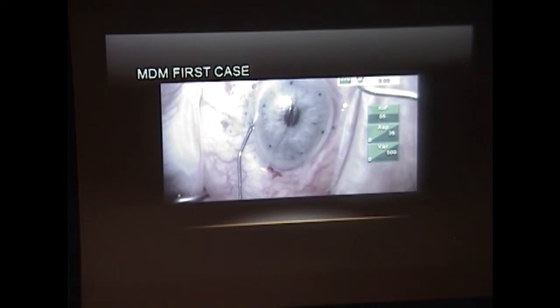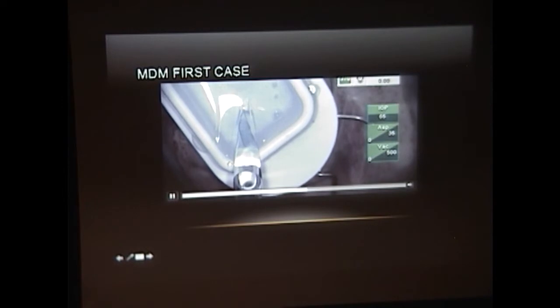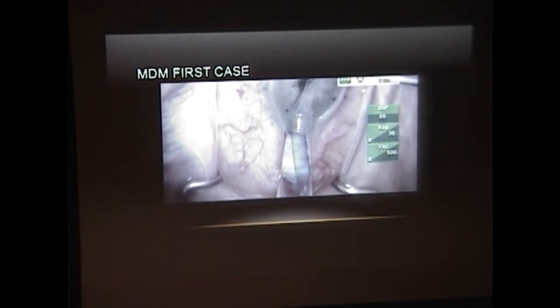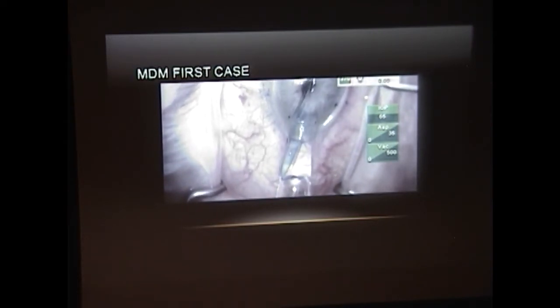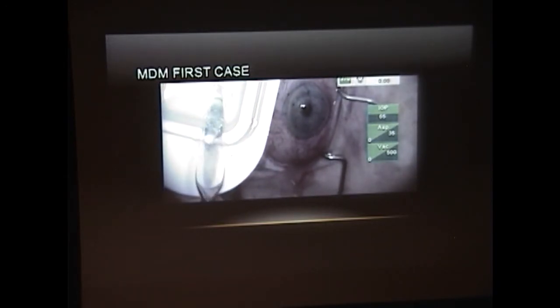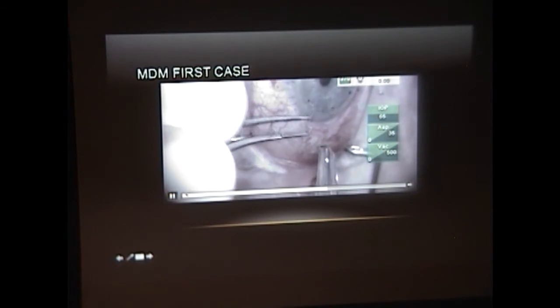So we ran out of BSS, so we deepen up the chamber, fill our tube back up with BSS, and try again. And the same thing happens. A little movement, but then we run out of BSS again. So this time we're going to go in and we figure we should turn the bevel of the injector up so that we're not bumping into iris, bumping into anything. And then hopefully it'll come out.